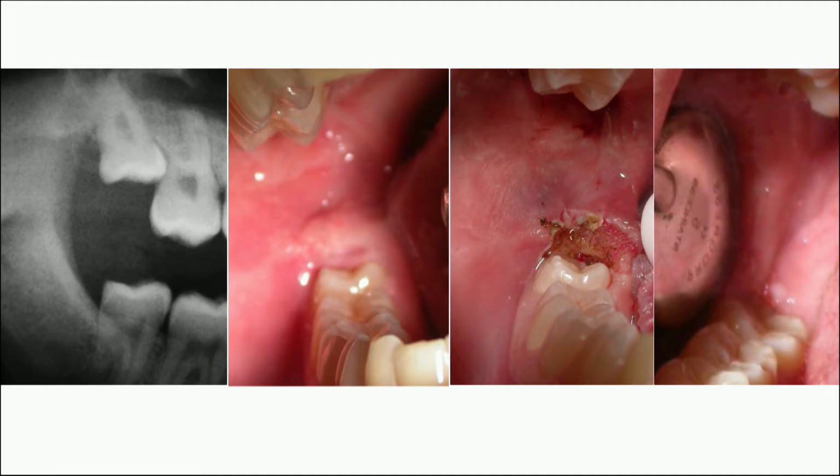Do we have any concerns about lingual nerve damage in a case like that? You always need to think about where the lingual nerve is, absolutely, and I normally use something like a flat plastic as I'm going with the laser to make sure there is absolutely no way that the laser or energy from the laser could extend onto the lingual surface. Absolutely, that's a very good technical point, always.